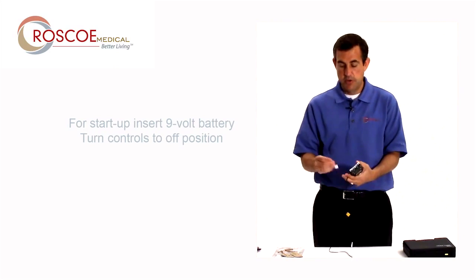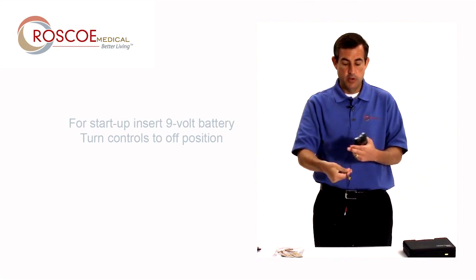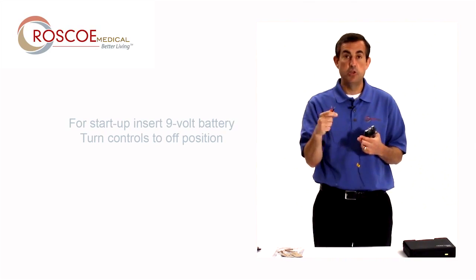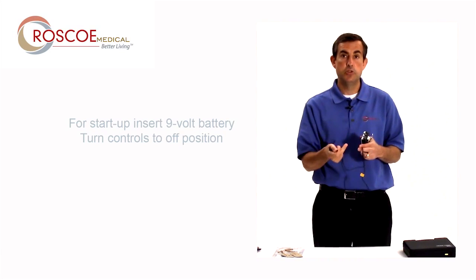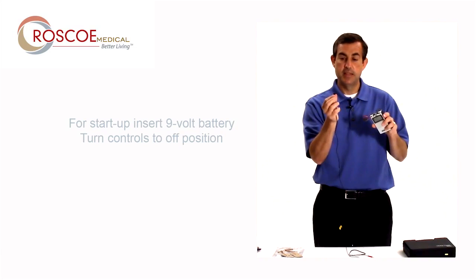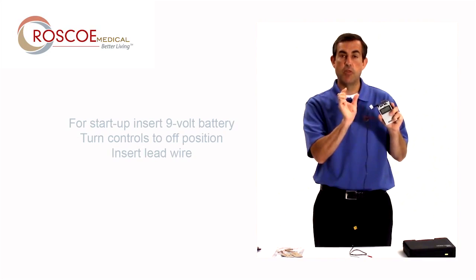The next thing you do is take out one of your lead wires — you get two of these. One lead wire goes to two electrodes. So if you want a two-electrode setup, you just use one lead wire. If you want a four-electrode setup, you use two lead wires. Today I'm just going to do a two-electrode setup. I'm going to take the lead wire and put it right on top and insert it into what we call the channel.